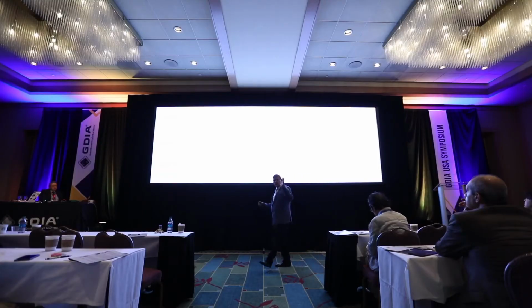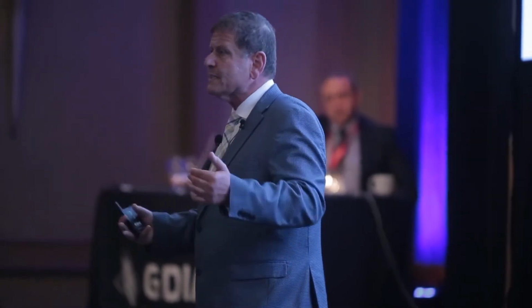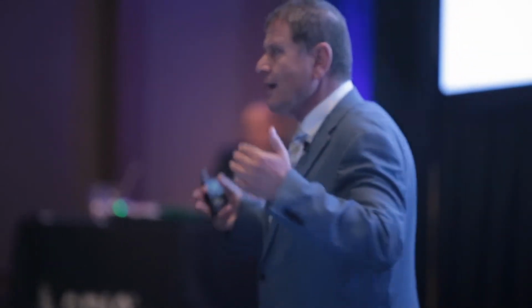And by the way, the mechanism of action of calcium sulfate is not integration. When you place the material, the only time that it comes in contact with the bone is the moment that you place it. It immediately starts to degrade, releasing tons of calcium ions, which start a biological process to precipitate in the form of HA and calcium phosphate lattice work of the bone. Now, the presence of calcium ions encourages the pluripotential stem cell to differentiate into osteoblast.